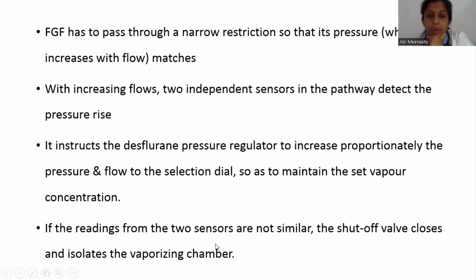If the readings from your 2 sensors are not similar, the shut-off valve will close immediately, isolating the vaporizing chamber. No more pressure will be regulated. No more vapor will be regulated.